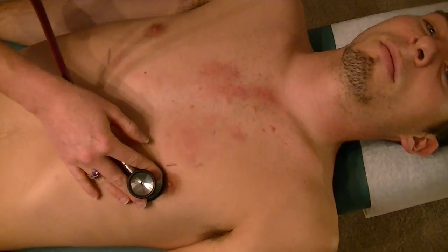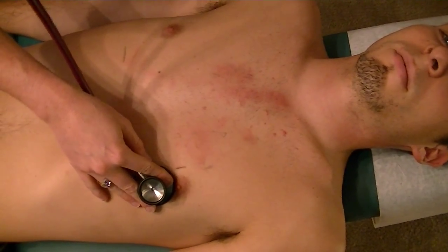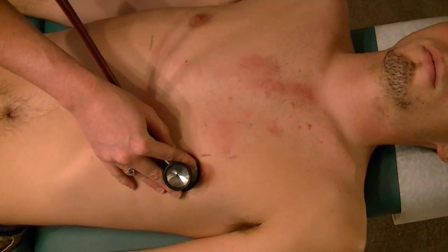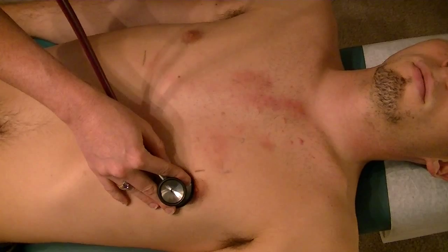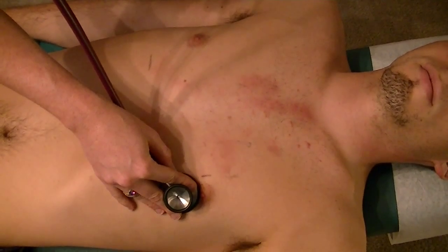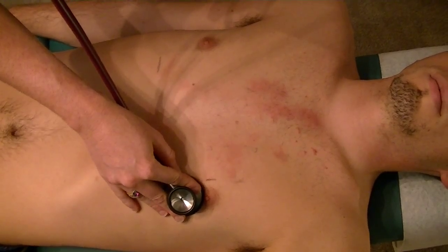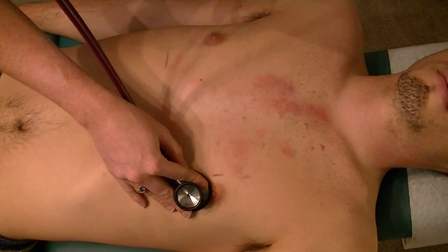Then once you get down to the mitral area, you're using the diaphragm again to listen for S1, and S1 is best heard at the apex of the heart, which is here at the mitral area, also known as the point of maximal intensity. So you're staying there and you're now listening during systole, stating that you will be listening to S1 to see if it is either accentuated or diminished, and you'll be listening for splitting of S1. And then you state that you are then listening for systole for murmurs or for other abnormal heart sounds.